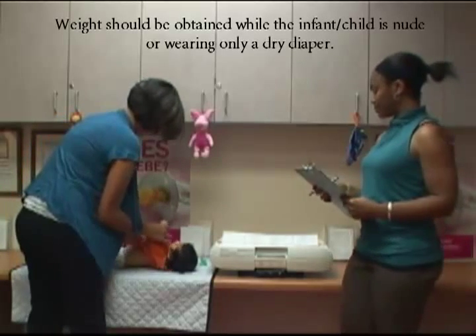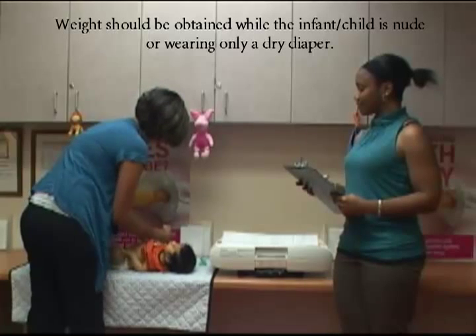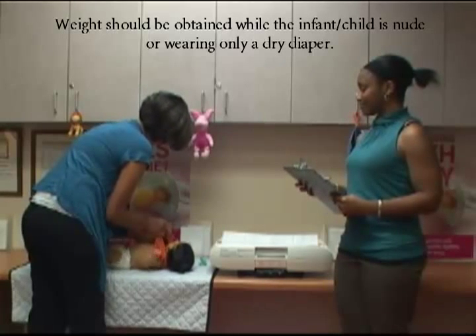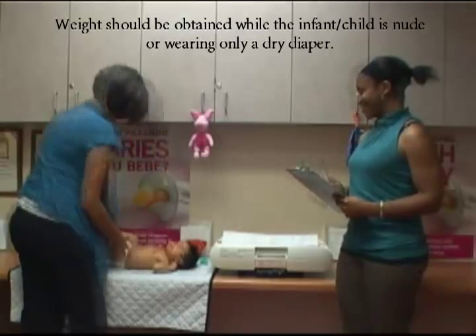Also, have the caregiver check the infant's diaper and change it if needed, because a full diaper could weigh up to 2 pounds. Make sure a paper liner is placed onto the scale before weighing and that the scale is on and set to zero.